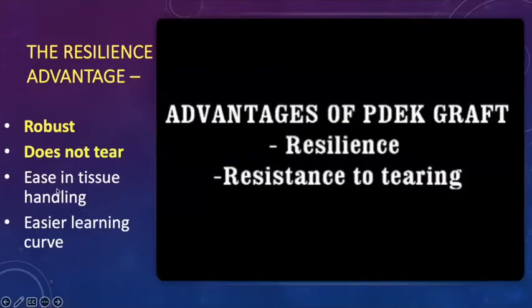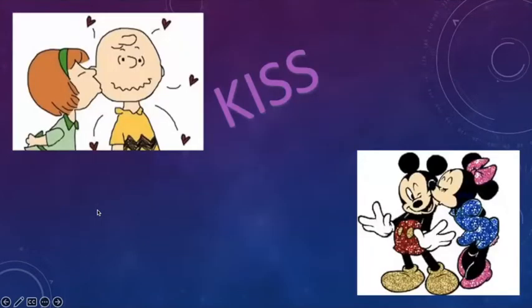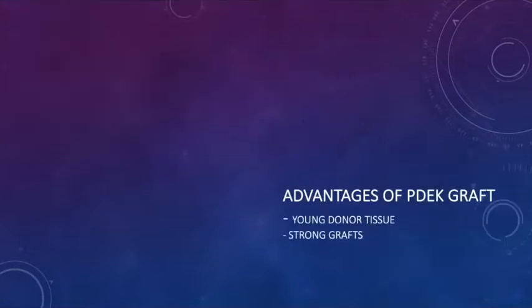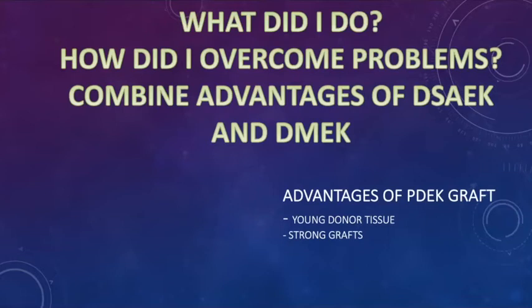The other advantage is that it's got an easy learning curve. Because of this robust nature of the graft, you really have much more ease in tissue handling. It's very similar to a DSAEK graft, and so it combines the advantages of both DMEK and DSAEK, in that you get very thin grafts which have their own advantages, as well as very easy surgery. So the advantages of the PDEK graft, as I said, are young donor tissue and strong grafts.